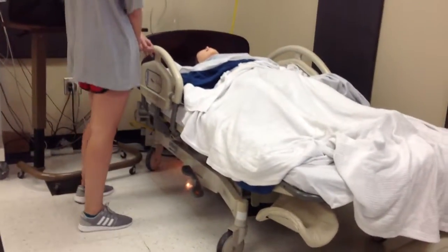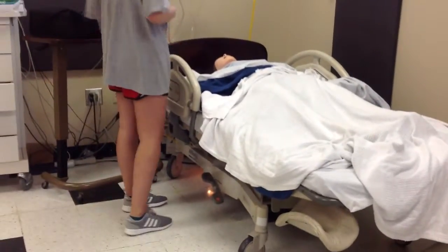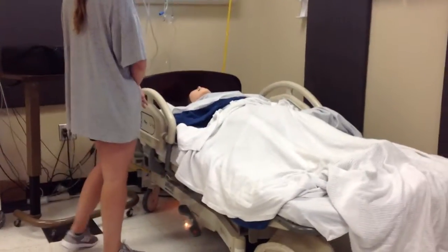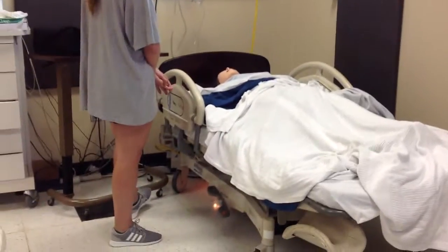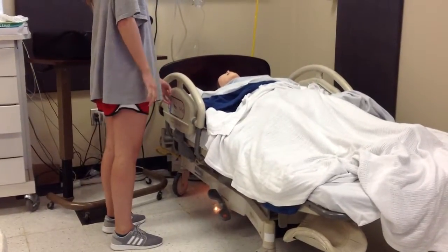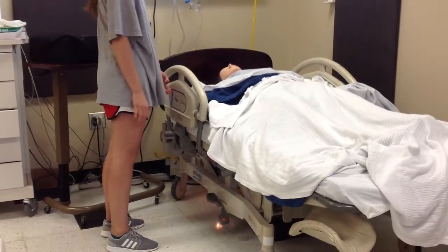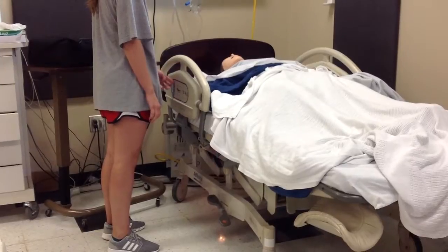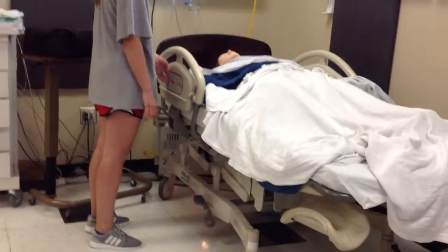Today I'm just going to perform a bladder scan on your tummy and it shouldn't hurt at all. And then I'm going to perform a straight cath, which might have a little bit of pressure, but it will help you out. I'm going to raise the bed. Do you have any allergies, especially latex or iodine? Nope, no allergies.